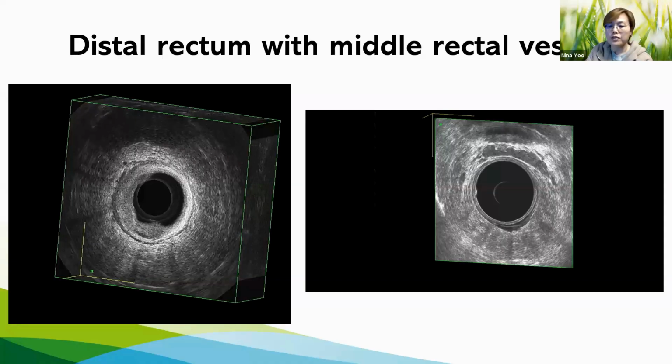If the cancer is located too low in the distal rectum, it penetrates adjacent organs like the vagina or prostate, or too much of the pelvic floor, then I have to do the more extended surgery. Compared to MRI, it gives me, in several ways, a lot more advantage.